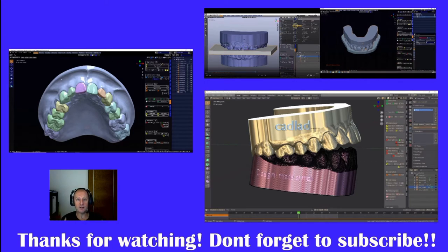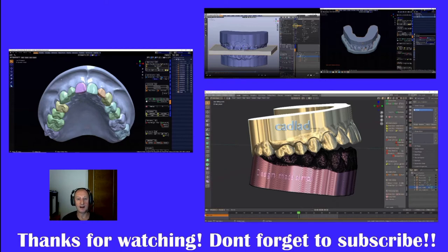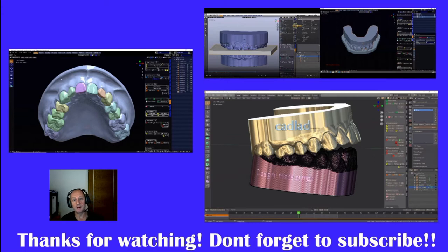However, this is only a Wax-Up diagnostic and temporary module, so we can't do definitive crowns. There's things missing that will be added when the crown and bridge module comes out.